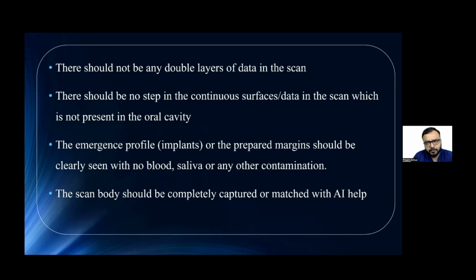But if you start from one end and you jump to the other side and try to meet in the middle, sometimes you will get a step in the central incisor area. So all these things should be avoided and can be very easily avoided if you just follow the protocols recommended by the company. The emergence profile of the implants or the prepared margin should be clearly seen without any blood, saliva, or any other contamination on it.